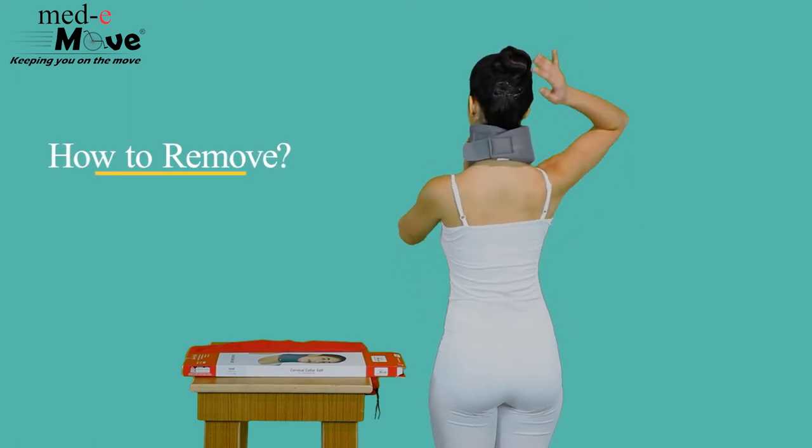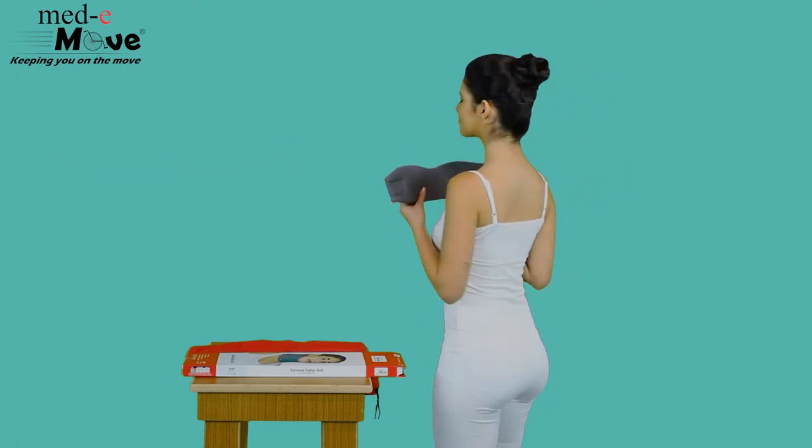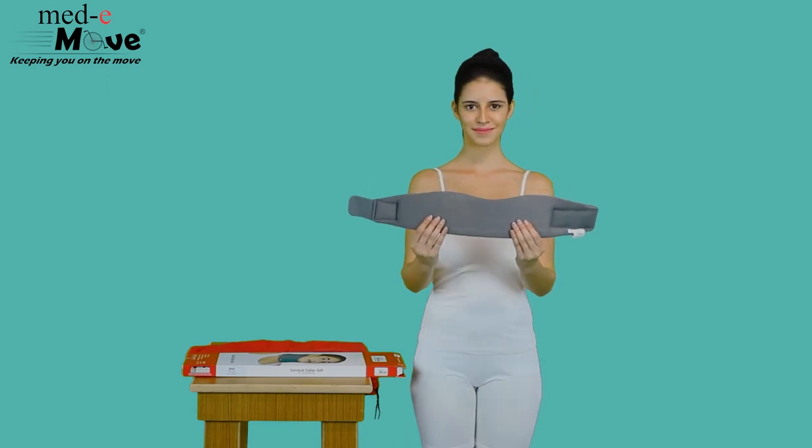Now let us see how to remove the Medimove Cervical Collar Soft. Simply unfasten both the hook and loop closures enabling easy removal.